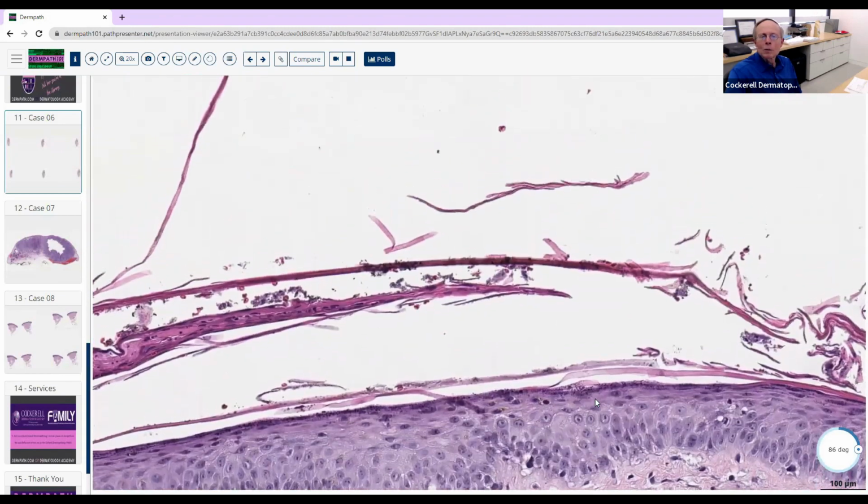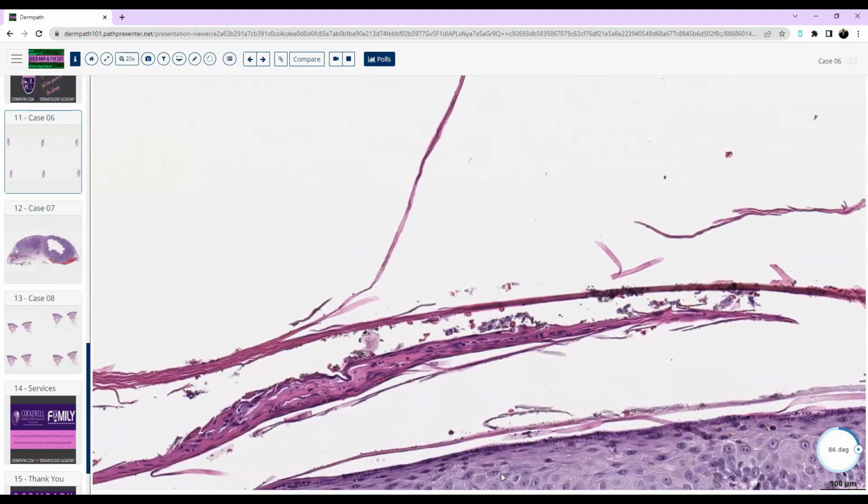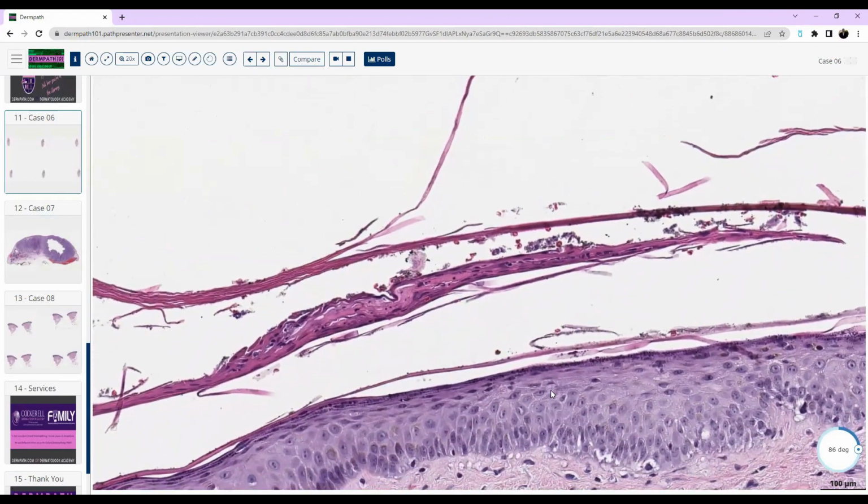I think you typically wouldn't see the EOs in those, like tinea or bullous impetigo. Well, believe it or not, anytime you get any kind of infectious disease, you can sometimes get some eosinophils in there. And so you do see it in tinea, actually, surprisingly. So that's just one thing. That's why I mentioned it to you. I don't want to let that throw you off.